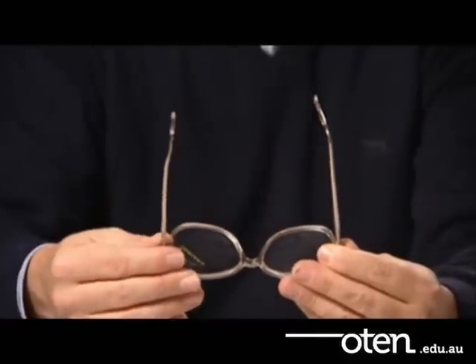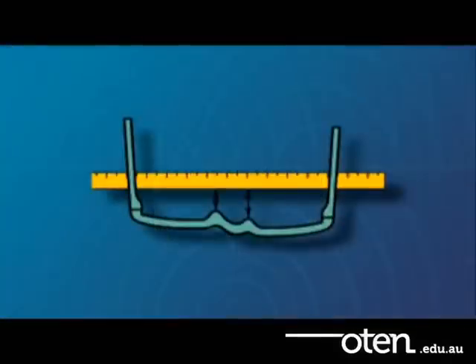Also look down onto the frame from above. If the lens planes aren't parallel, one will sit further forward than the other. Make sure you align the frames so that they sit equally in the same plane.